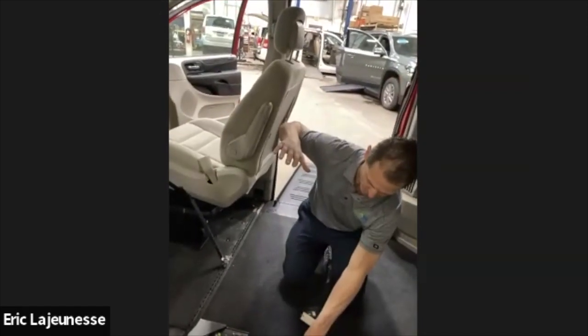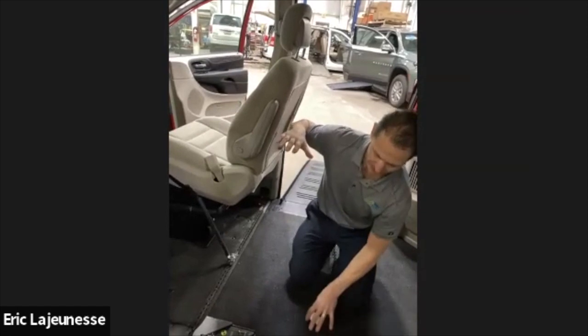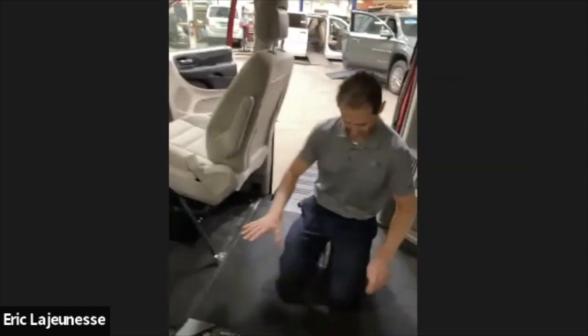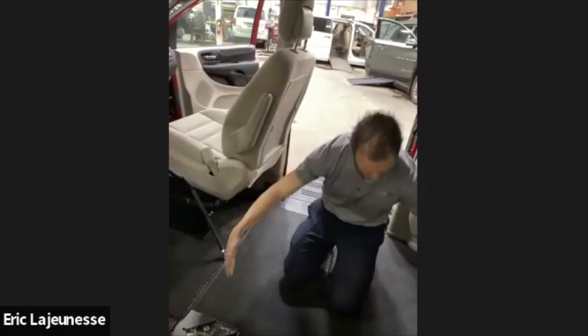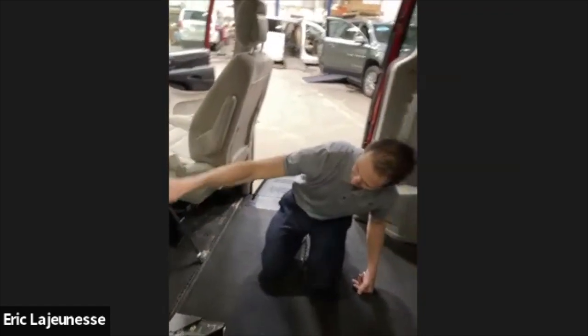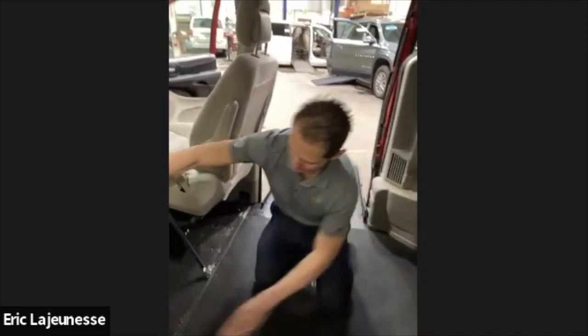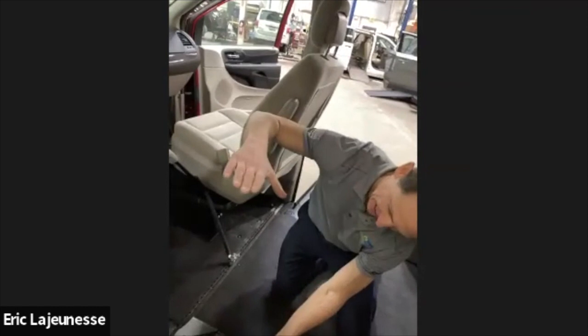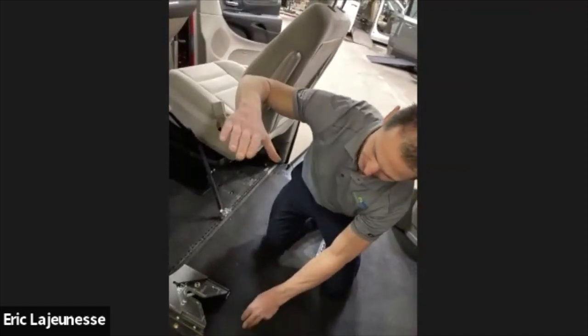higher than the floor. So that would be the tough part, because you come in, the floor is lowered only here, but then the front is not. So the transfer seat would have to come out and it'd be 10 inches higher than the floor that you're on with the wheelchair.